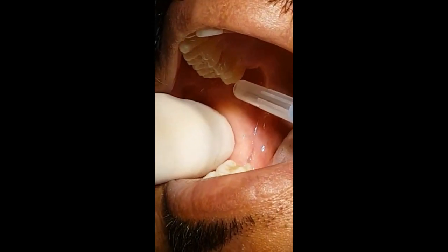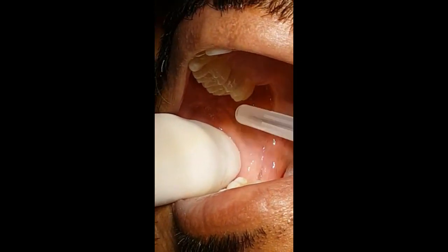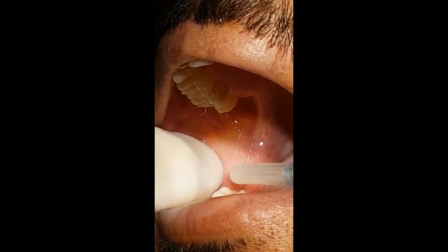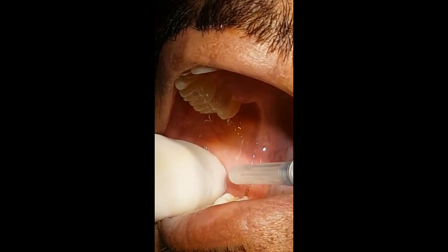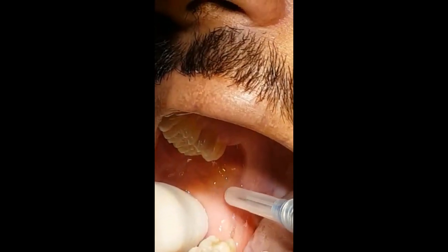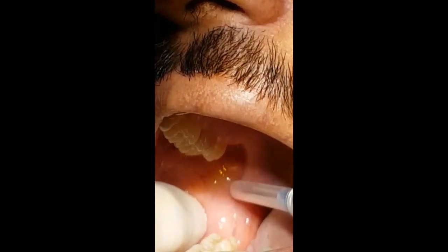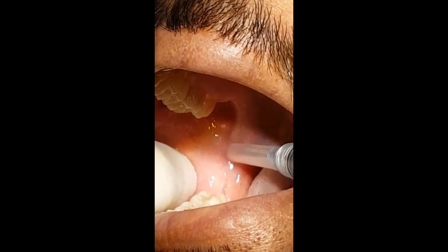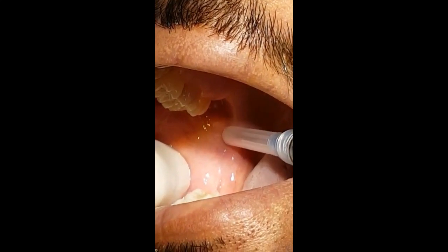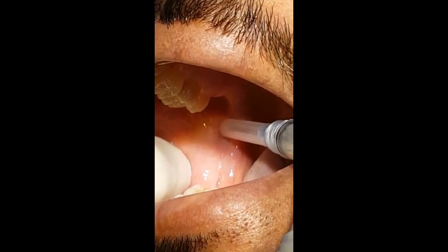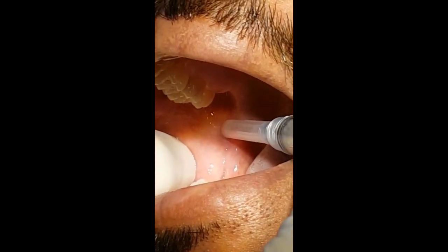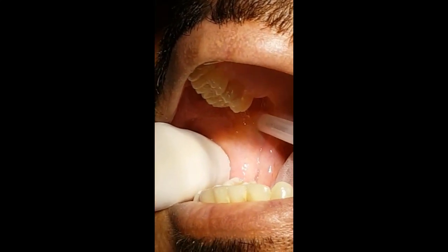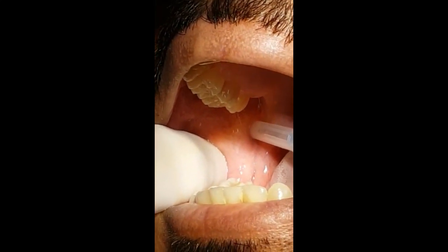Look at the space between the upper maxillary second molar and the mandibular second molar. Bisect that space in half — if you need to give a second injection, it should be higher than the midpoint, again lateral to the pterygomandibular raphe, coming from the opposite side. The second tip is always to go at a higher point than the first injection.